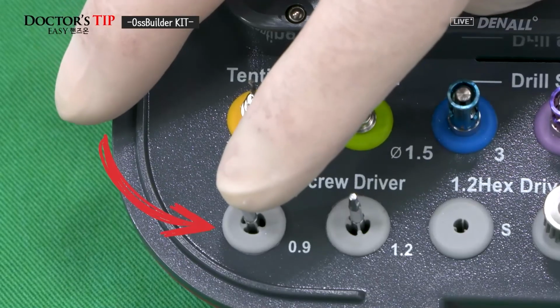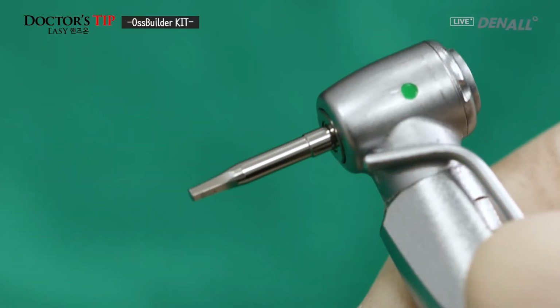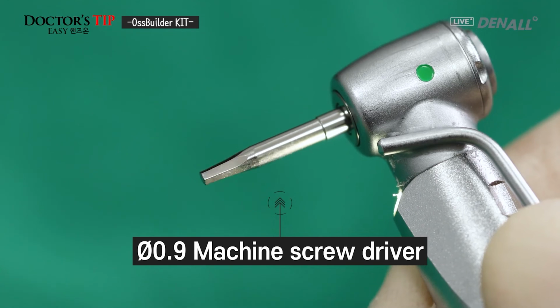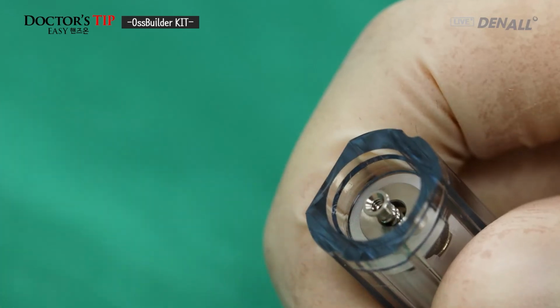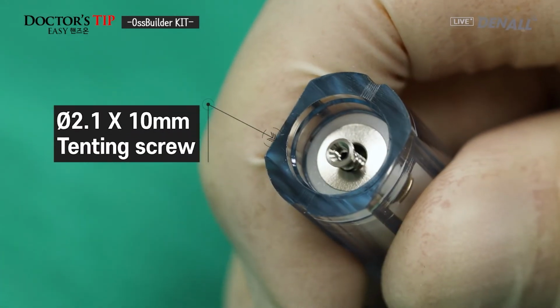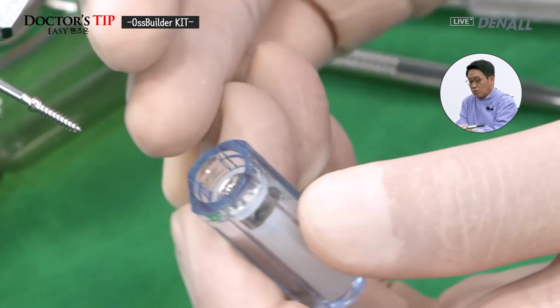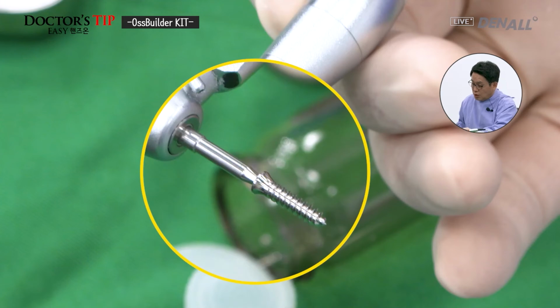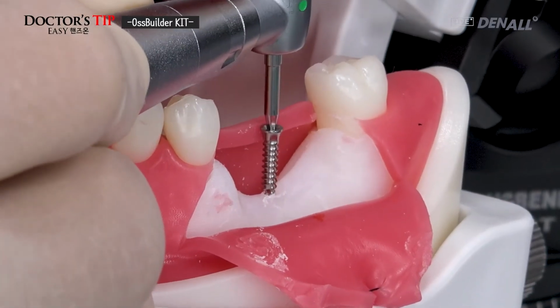Drilling is done. There is a machine driver for tenting screw. Connected to handpiece. Change to placement mode, as you can see. Diameter 2.1 by 10mm tenting screw will be used and connected to machine driver. On the drill hole that was created earlier, tenting screw will be placed. Now I'm going to do placement.